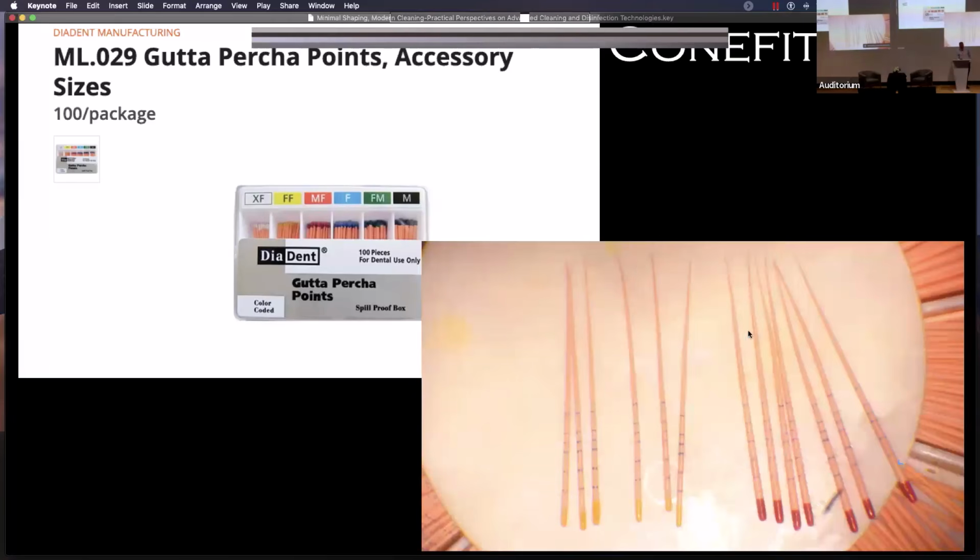So we're going to fit these cones in the tooth. They're supposed to be laser inspected. These are all supposed to be the same size. And if we look at them, they're not. I mean, we got this tiny guy here and chubby over here. Got kind of another chubby one, a medium one. And these are all the yellow fine cones here. And on the red, the medium fine cones, look at the difference in the size of these. It's a bigger cone, that's the red cone, with tip sizes smaller than the yellow cone. So they're all over the map.